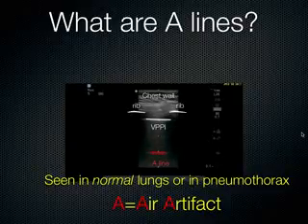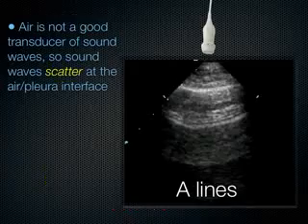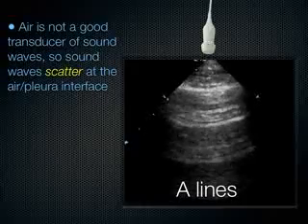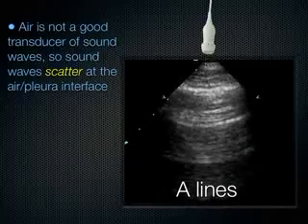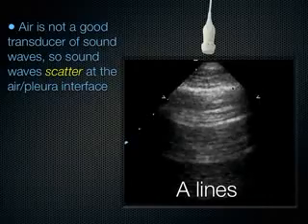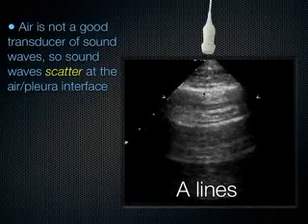Or sometimes you can see that in the setting of a pneumothorax, if it's not sliding. Again, there's those distances there. They're normal. So air doesn't transmit sound very well. In fact, the air scatters the sound everywhere. But I love seeing this again. Here's the skin line. We come down. This is the VPPI. It's sliding back and forth. It's sort of subtle there. See that sliding right there? That's the lung up against the chest wall sliding back and forth.